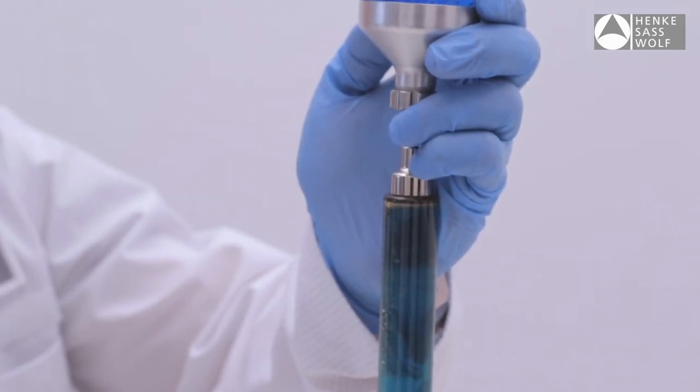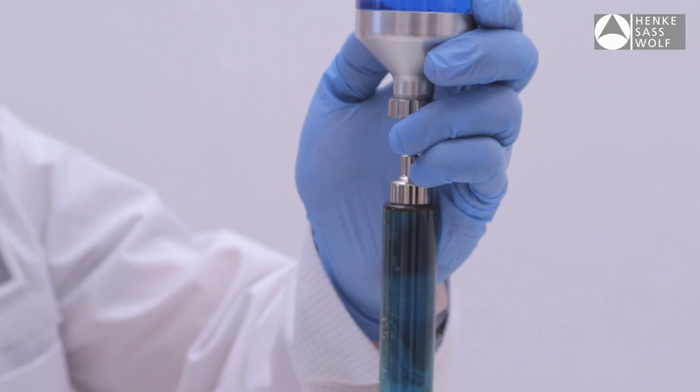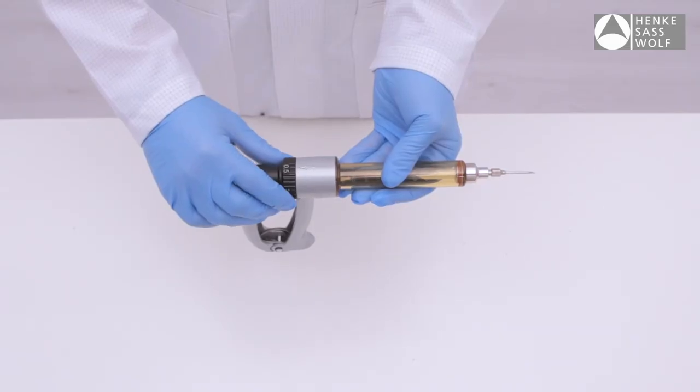Remove air bubbles inside the barrel by pressing the piston slightly forward until air bubbles are removed. The dosage can be adjusted by turning dosage wheel either clockwise or anti-clockwise.